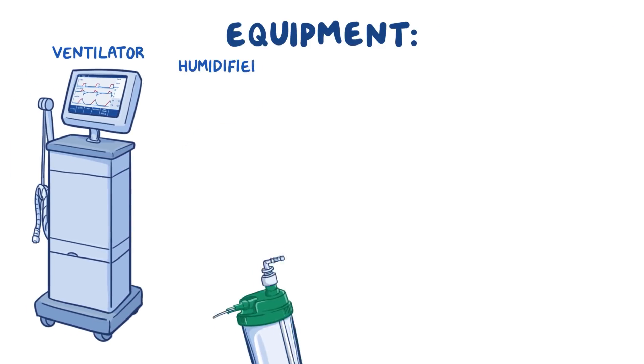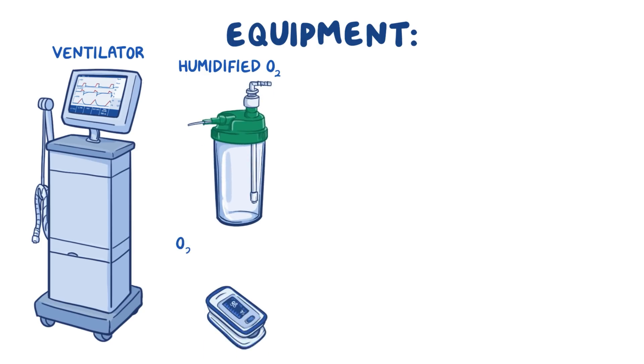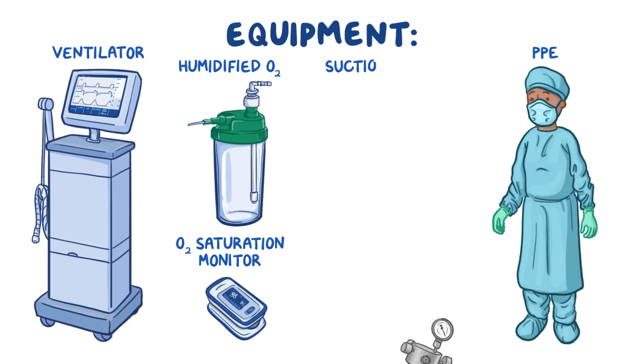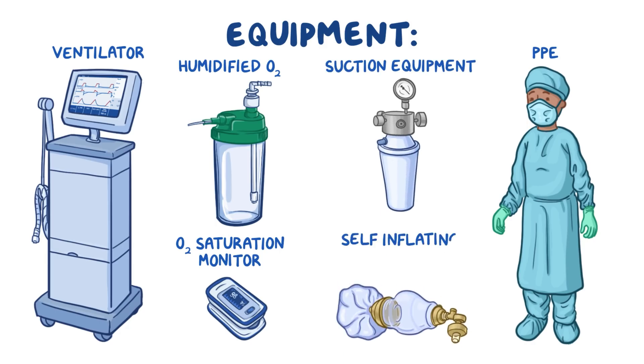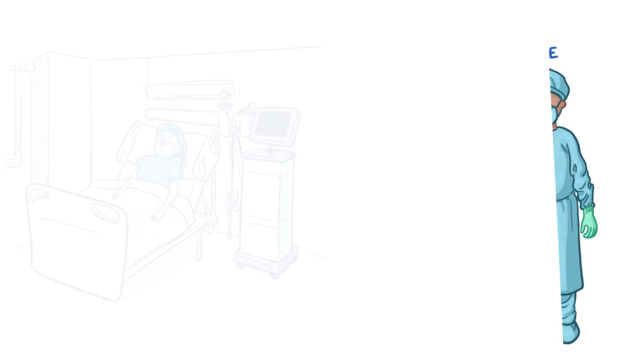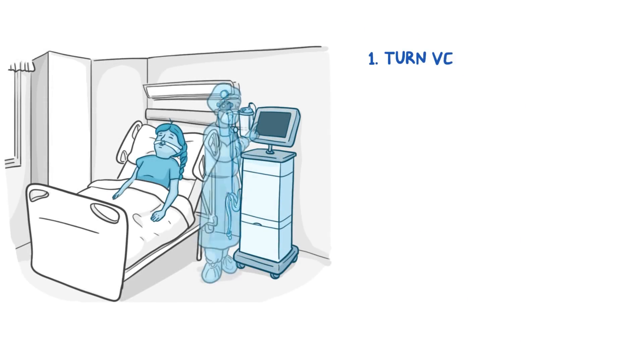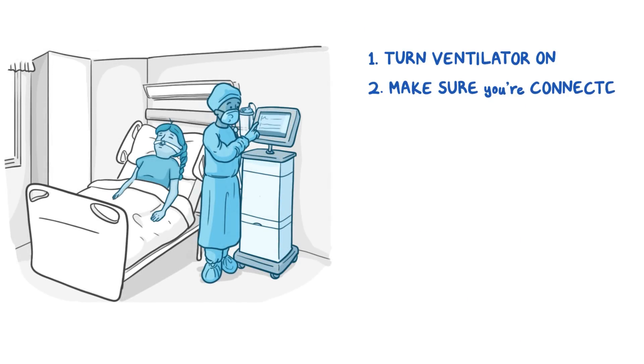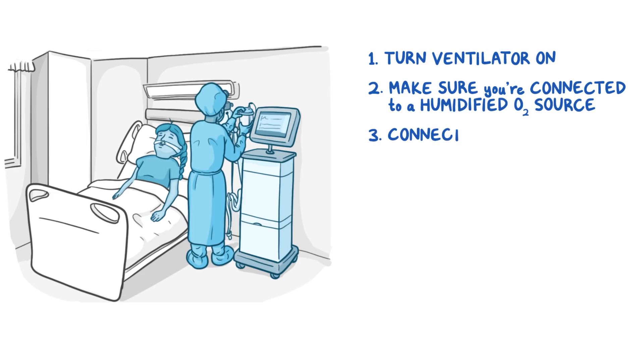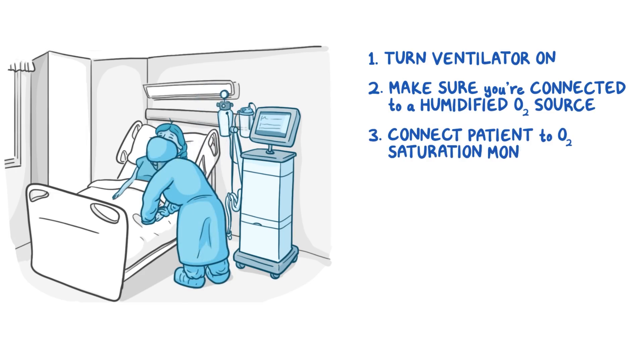Here's all the equipment you'll need: a ventilator, humidified oxygen source, an oxygen saturation monitor, personal protective equipment, suction equipment, and a self-inflating bag. To set up your patient, turn your ventilator on and make sure you are connected to a humidified oxygen source. Then connect your patient to an oxygen saturation monitor.